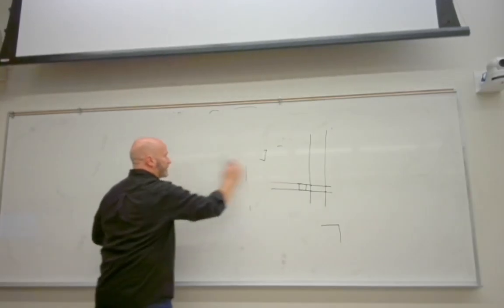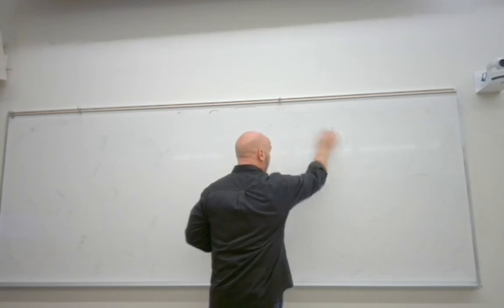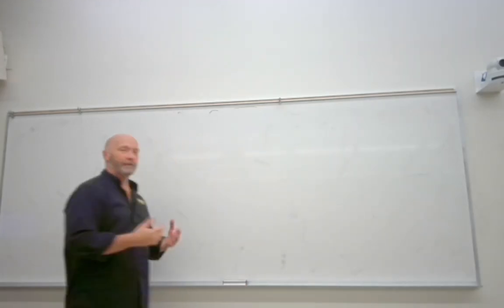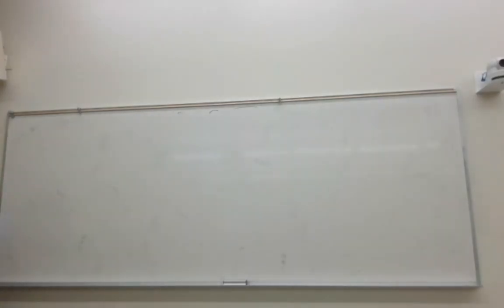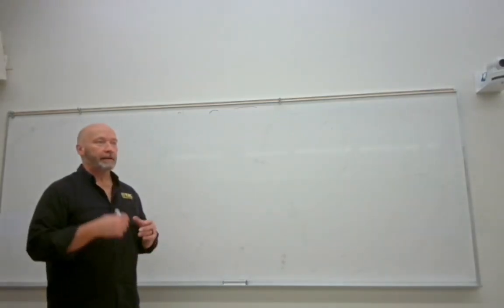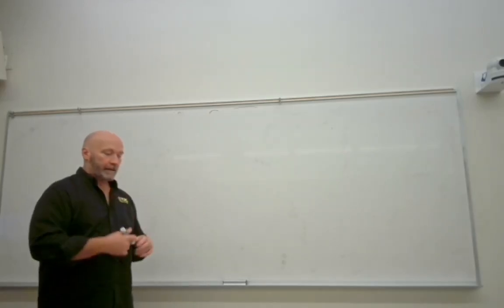So the control panel controls the quantity or quality of your X-ray beam. Other things I did not point out: focal spot size. You can select different focal spots. We'll talk about that, I think, in the next section. But you control the X-ray beam completely at your control panel, right? And it should be outside of the room.